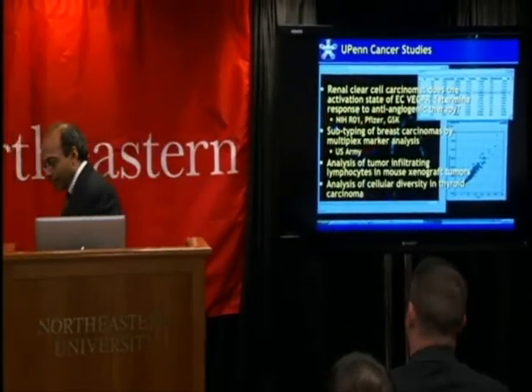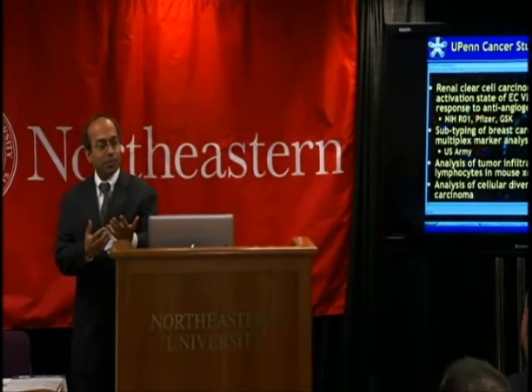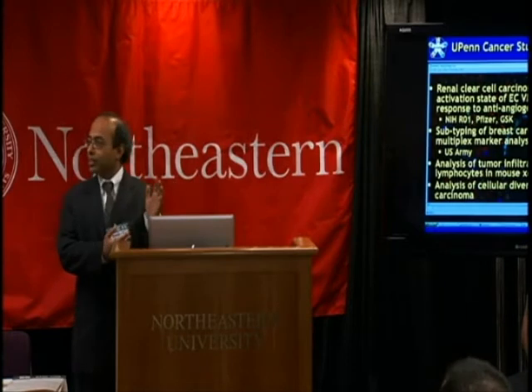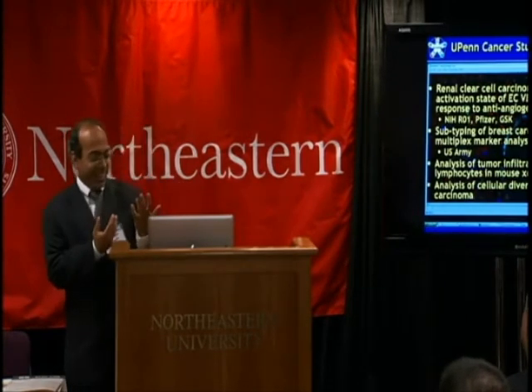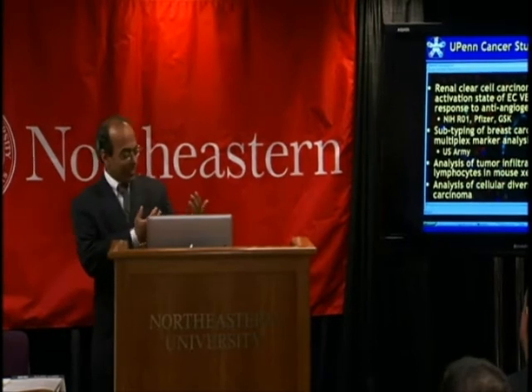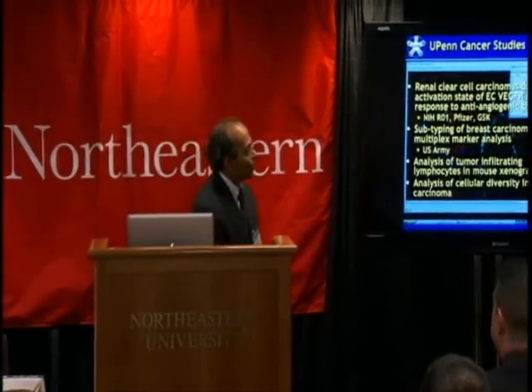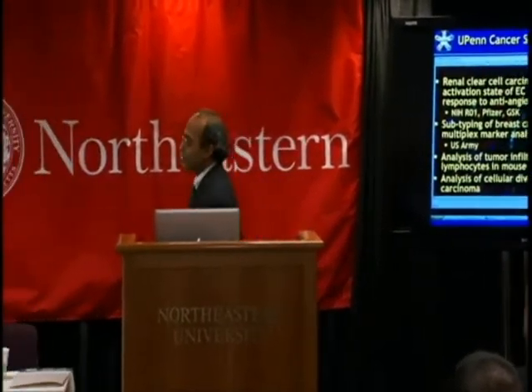She's from Japan. I hope I'm not mangling her name. She was sitting there with her laptop, and at the end of my talk, she came and showed, said, it works. She had downloaded the whole thing, the whole open source tool from our website, and ran it on her data. And I was kind of freaking out and happy at the same time. So to make a long story short, there has been a mini explosion of translational adoptions of this software.